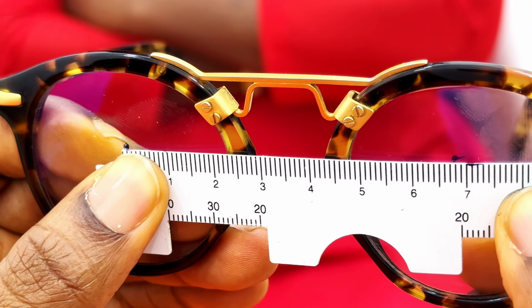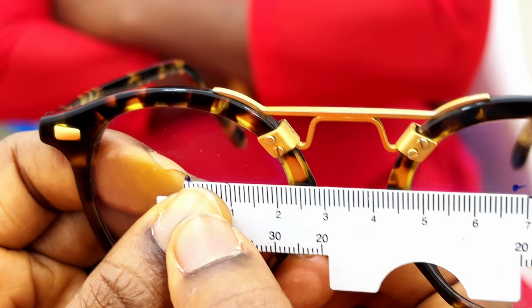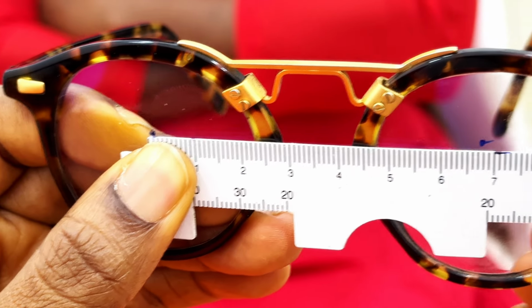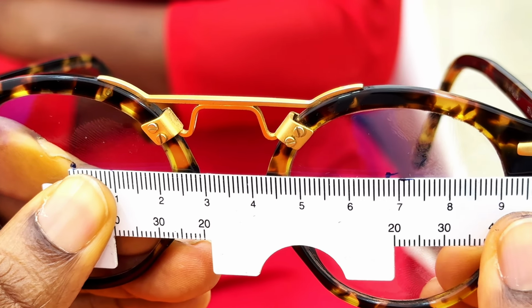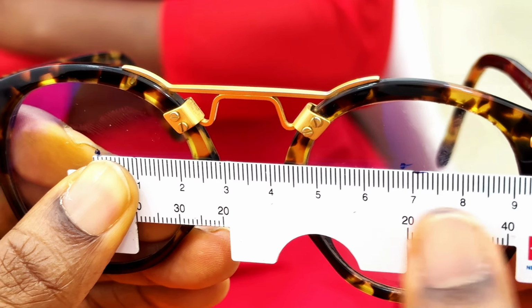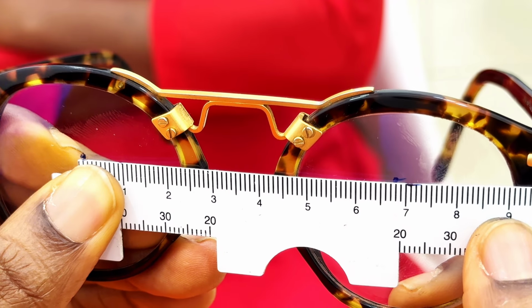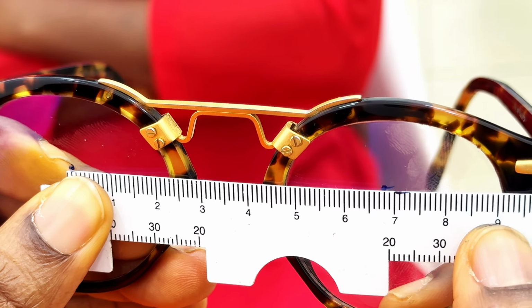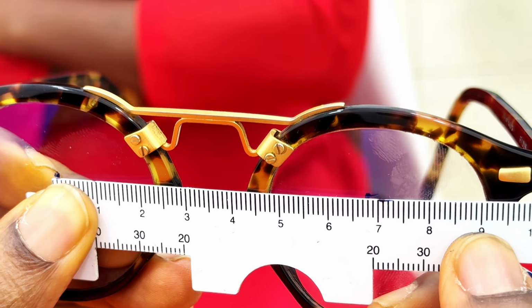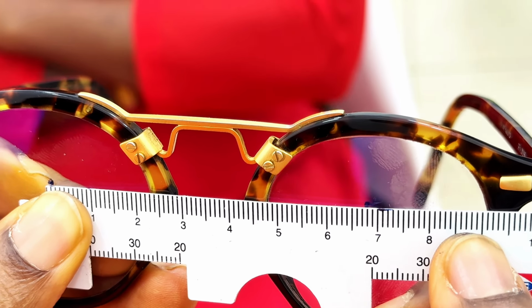So let's get our monocular PD. For our right monocular PD, we measure from the right dot to the center of the nose bridge of this frame. And from the right dot to the center of this nose bridge is about 36 mm. That is for your right PD. So how do you get your left PD? You just simply subtract the 36 mm from 68 mm, which is what we got as the binocular PD.